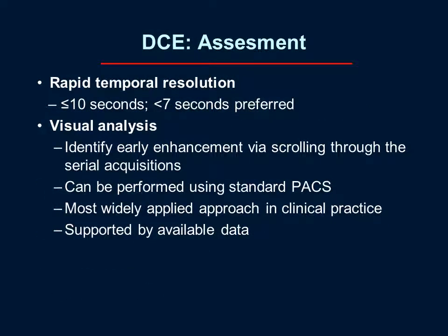So now just one additional sequence to talk about that's included in many prostate MRI exams, and that's dynamic contrast enhanced imaging, or DCE. So PI-RADS advises us to do DCE with a rapid temporal resolution of at least 10 seconds, with under 7 seconds being preferred. And at least in PI-RADS, it's indicated we can evaluate this with a visual assessment, in which we're essentially looking for early enhancement simply by scrolling through serial acquisitions, which we can do using a standard PACS.